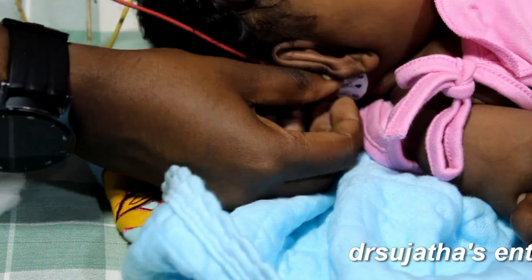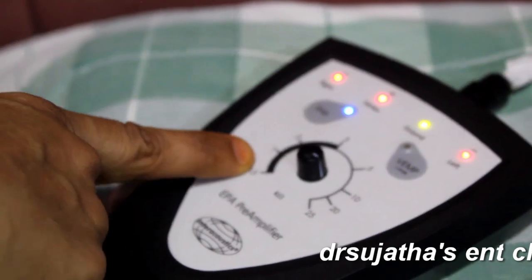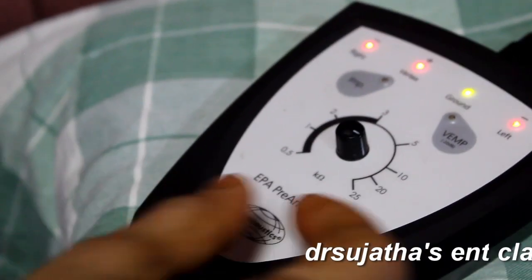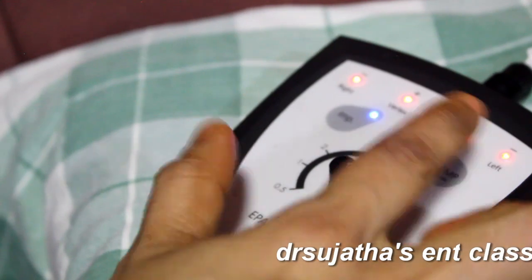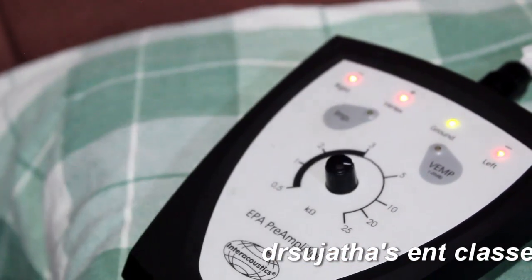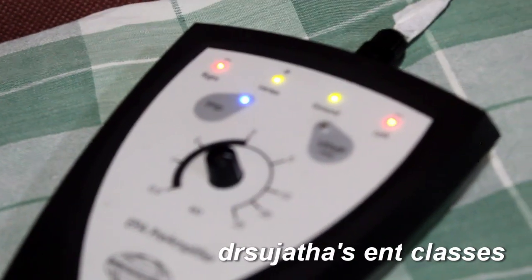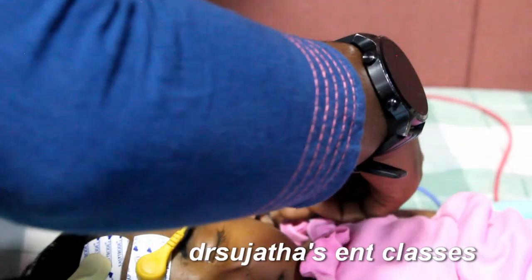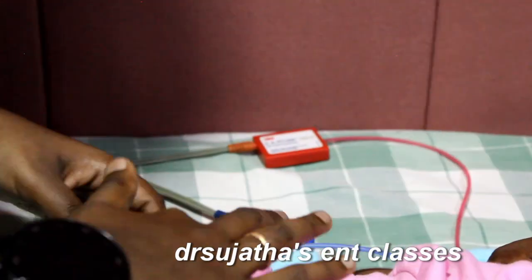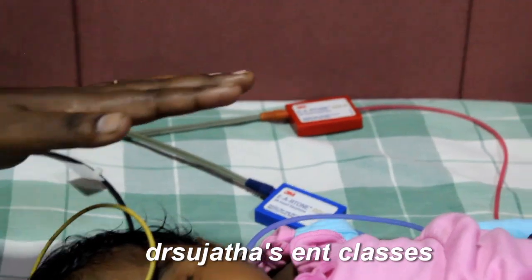We can watch the level of impedance in the machine. See here, the high colored black area, ideally it should be in that black area. And in this case the impedance is very high. So again the electrode has to be removed and reinserted after thorough cleaning of the skin. Now the impedance level is comparatively low. And the insert earphones are kept in infants like this. Again blue on the left and red on the right side. And the click stimulus is given.